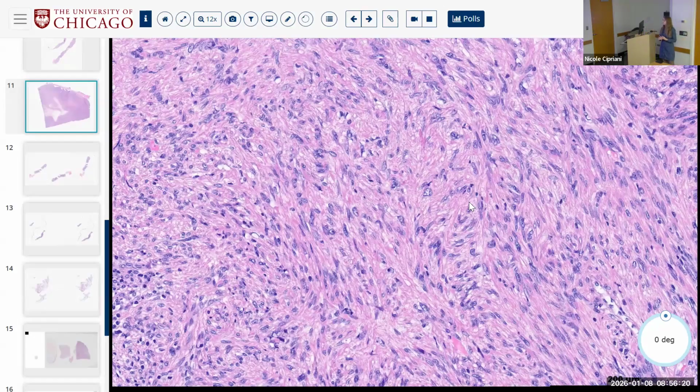If you were in the retroperitoneum, that would inevitably be the answer. It's always dedifferentiated liposarcoma with heterologous differentiation. In the deep soft tissues, though, you can get other non-lipomatous tumors, some of which can stain with MDM2 but not be amplified, in which case they're not liposarcomas, and some of which are amplified.